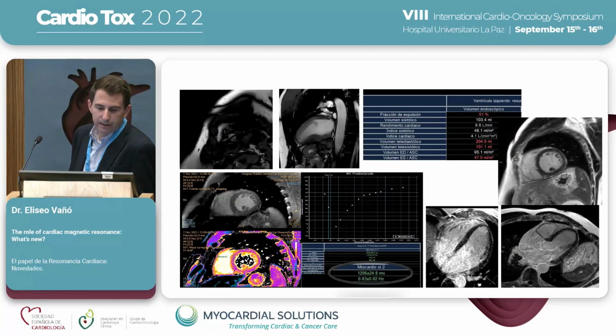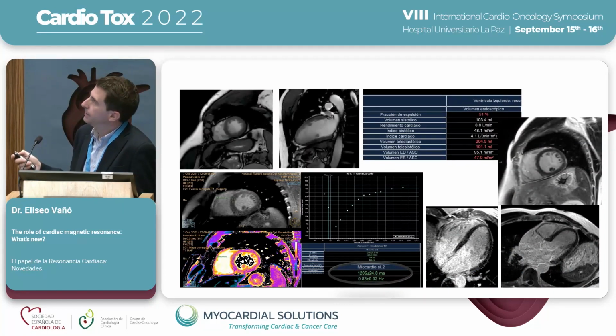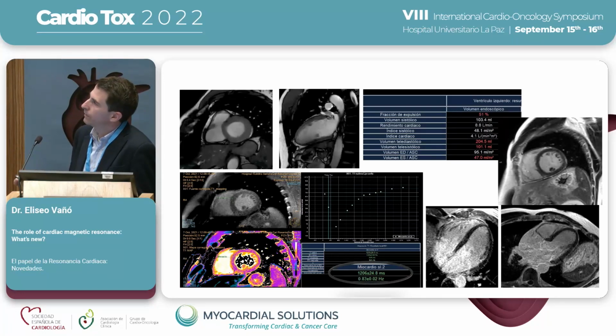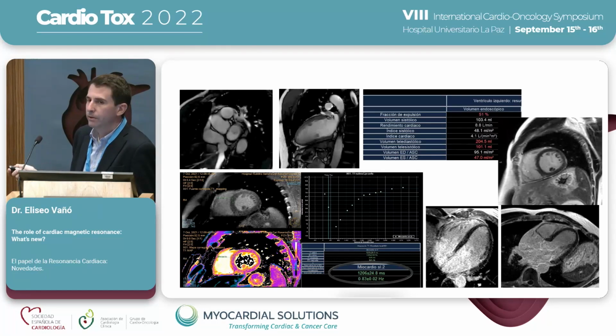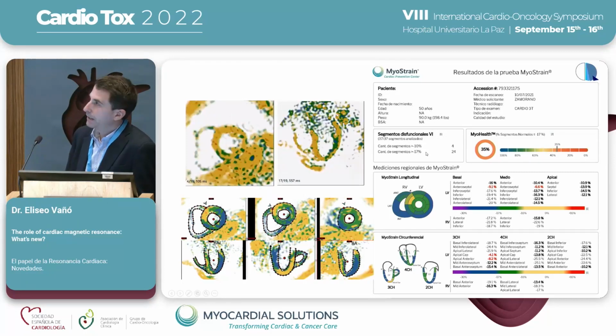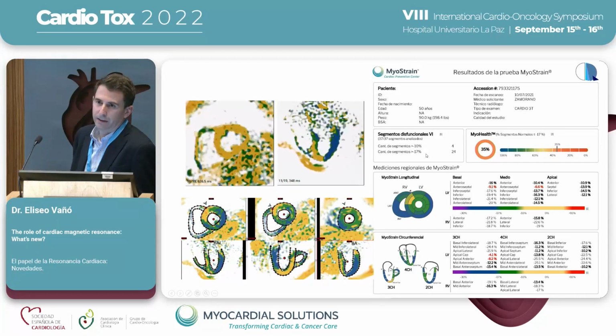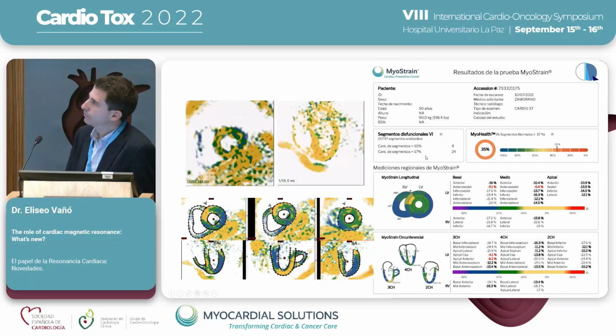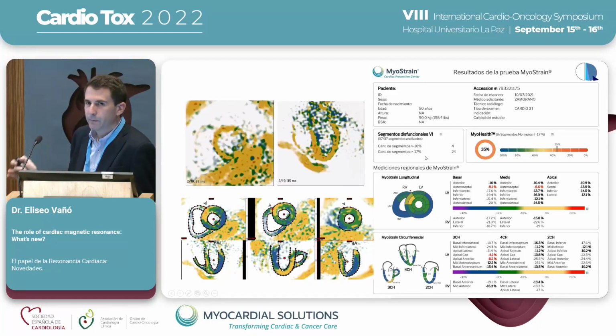And this is the typical clinical case where we have an ejection fraction near normal, 51%, with a normal T1 mapping in a 3 Tesla scanner here, and normal late gadolinium enhancement. This is an almost normal patient. But when we acquire myostrain, we get this MyoHealth of 35 that is clearly pathologic, not normal. Below 70 is not normal and can have prognosis implications. So we can stratify patients and find which patient will need cardioprotective management.